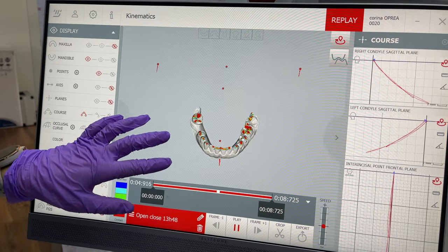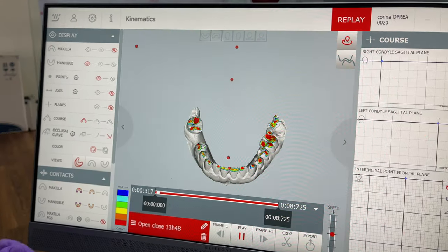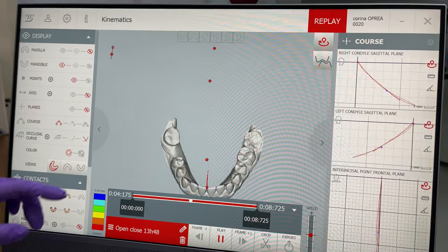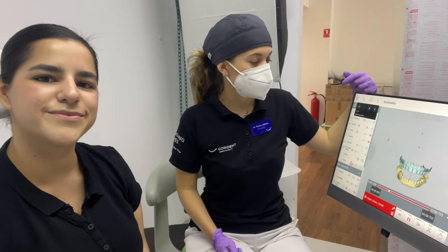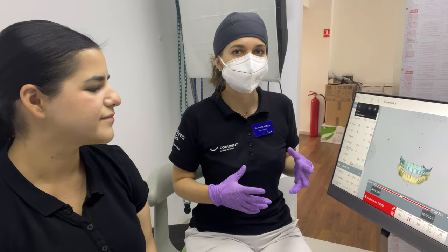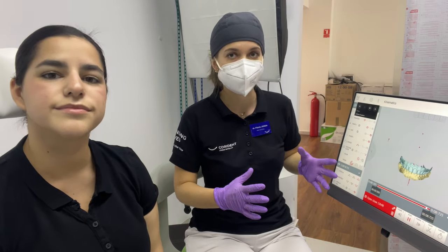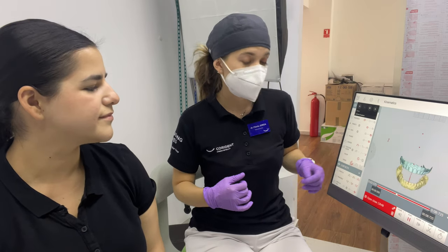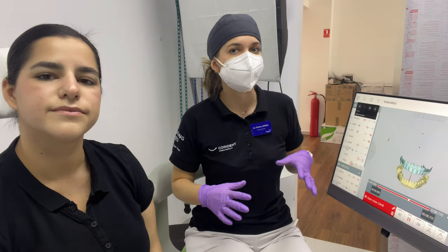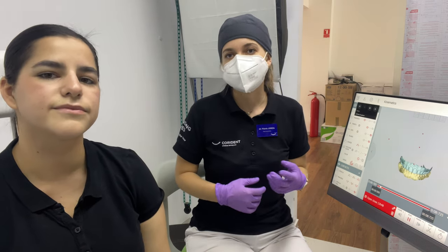And now you can see the forces on the teeth. She has quite a harsh bite. See everything? Yeah. So at the end we check all the movements once again, so we can see now if there's something big happening here, if the movements were right and everything. Then we're going to analyze and make a proper diagnostic for our patient and see what's needed and what's going on there.